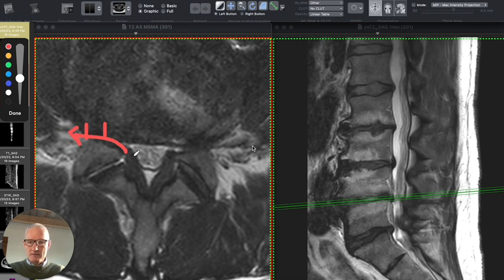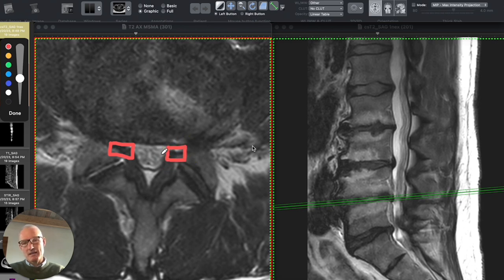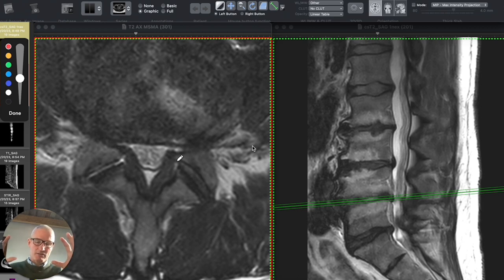In your particular case, you have a fair amount of subarticular zone stenosis at the L4-5 level. It's enlargement of the facet joints in this area that is trapping the L5 nerve root just underneath the facet joint. And that typically would cause pain across the back in a belt-like distribution radiating down the sides of the thighs, the sides of the calves, and frequently into the top of the foot.